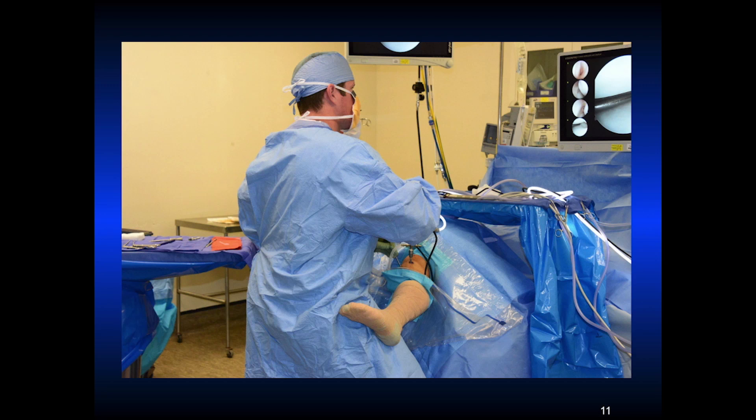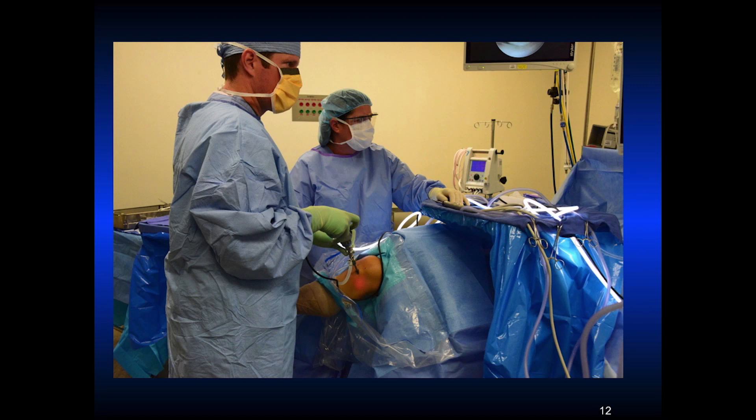This shows as we're proceeding. I like to apply pressure this way, putting the foot on my upper thigh. I have a step up so my foot is up on a step, and then I can easily change the flexion-extension of the knee and manipulate it to do the procedure. Sometimes you can cheat and see where the scope is looking by the light reflecting underneath the skin. The knee goes into varus, so you put it on your left leg on the left knee and go into varus.